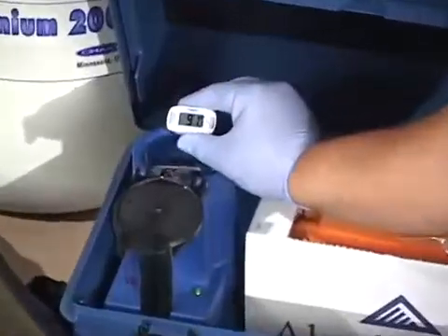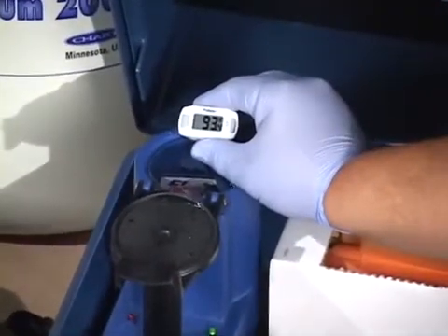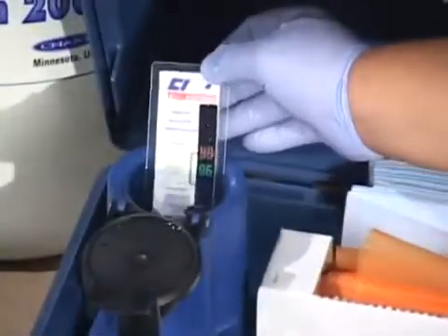Prepare the thaw unit, making sure that the thaw water is clean and between 94 and 98 degrees Fahrenheit.